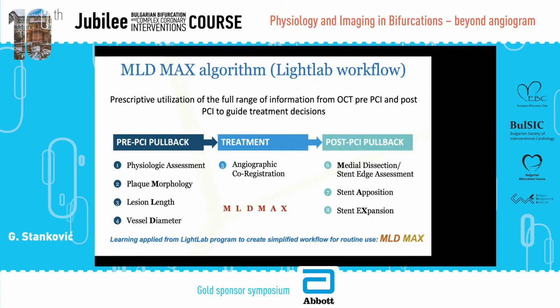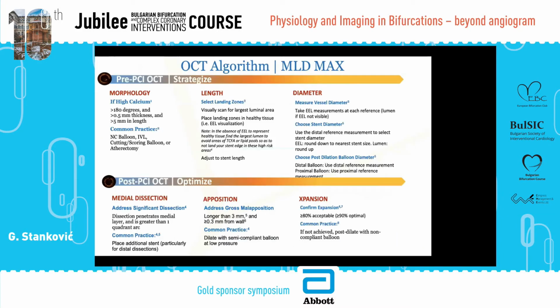During the procedure, we have the possibility of angiographic co-registration to make positioning much simpler. And the final post-PCI pullback should tell us if there is a presence of medial dissection, stent apposition, and stent expansion. This MLD MAX algorithm really shows how we are trying to integrate all the available knowledge to get maximum clinical benefit from the use of procedural guidance with imaging from the beginning throughout the procedure until the end.